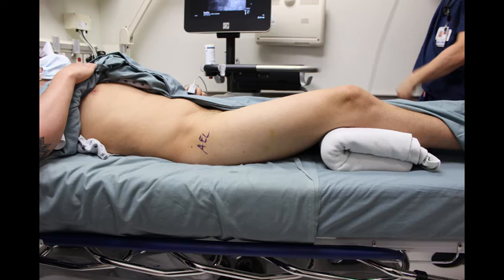The patient is placed and prepped in a sterile fashion in the supine position. A positioning aid, such as a pillow or blanket, is placed below the knee to provide slight hip flexion and decrease tension on the iliopsoas muscle.